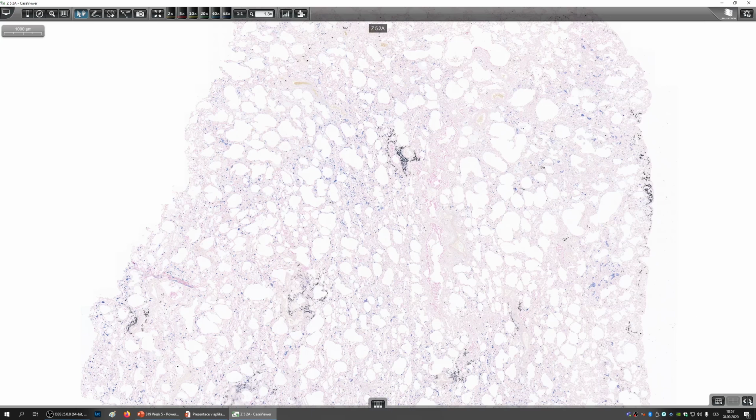And this condition develops when you have chronic heart failure, especially of the right side, because there's chronic venostasis within the liver as the blood isn't drained effectively enough from the vena cava inferior into the heart, usually due to failure of the right side of the heart. It could be due to pulmonary hypertension and so on. You learn about this in pathophysiology a bit more. Now I'm just concentrating on the morphological changes. So let's have a look at it. It's quite a characteristic picture.